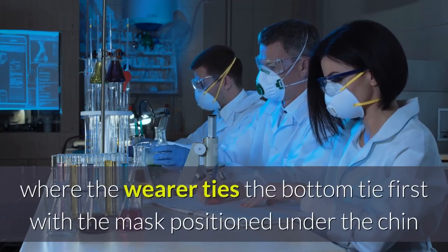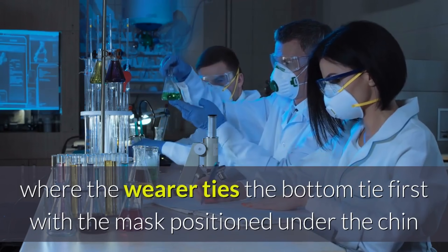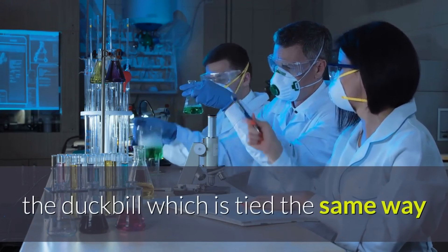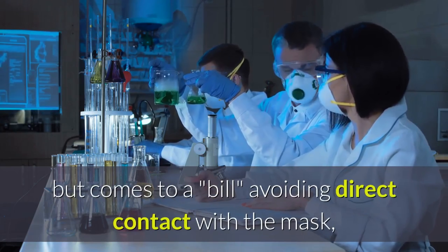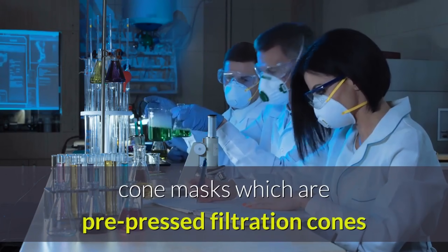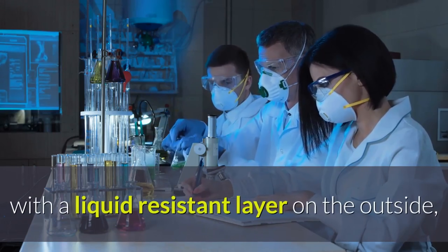There are different kinds of masks. Tie-on masks are worn by tying the bottom tie first, with the mask positioned under the chin and brought up over the nose and tied behind the head. The duck bill mask is tied the same way but comes to a bill, avoiding direct contact with the mask.